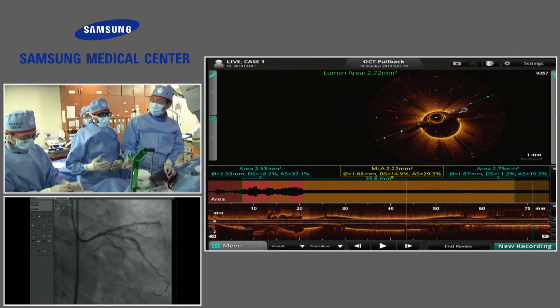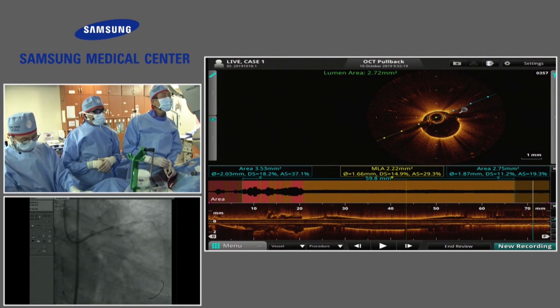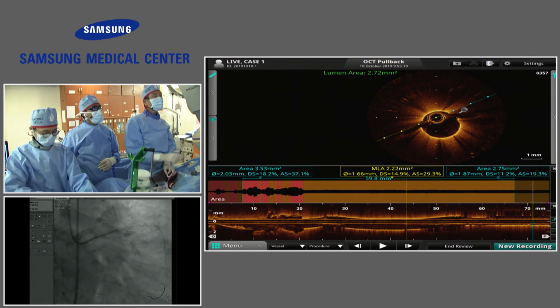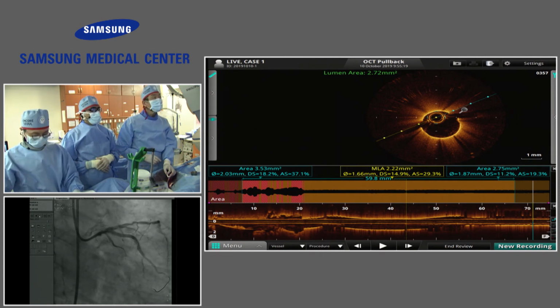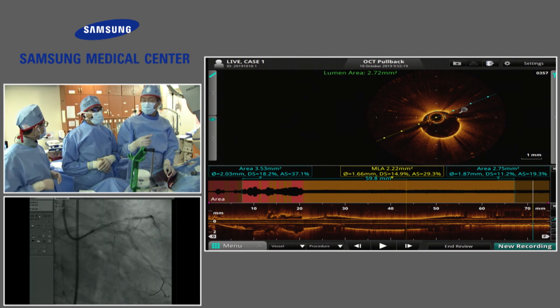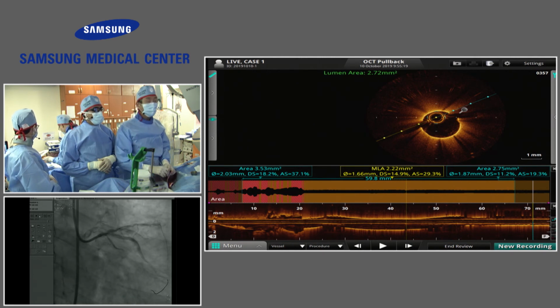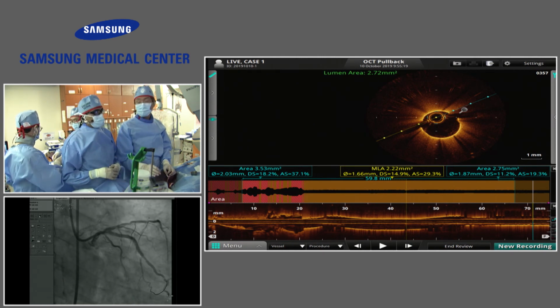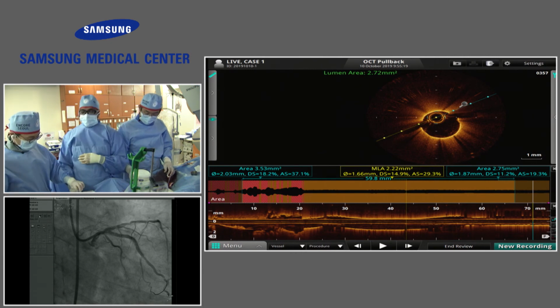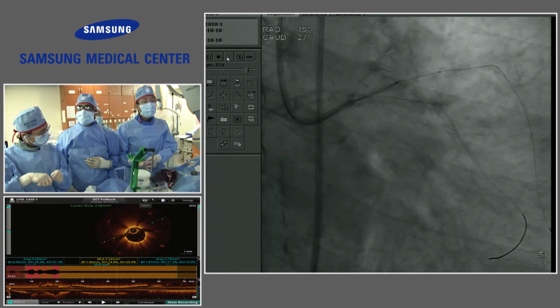So we're going to go a little bit more distally, with a 2.5, 3.0, 3.0 balloon. And the stent from the mid LAD to the left main. So we predilate that, and stent first the obtuse marginal to left main, with a 3.0 balloon, right? So secure the dissection in the proximal circumflex. We also now have a dissection in the LAD.